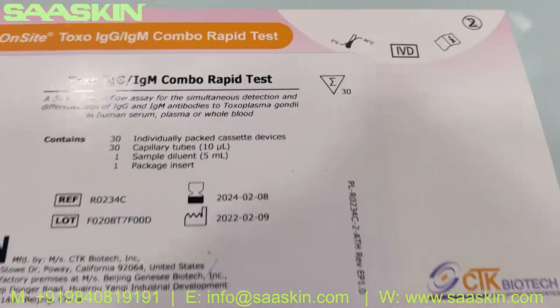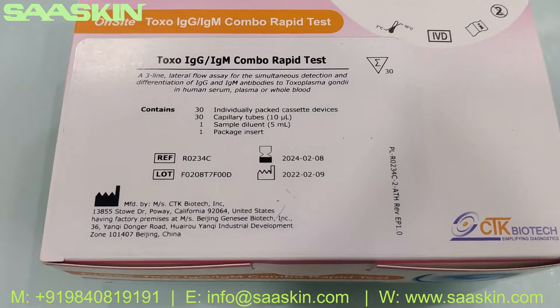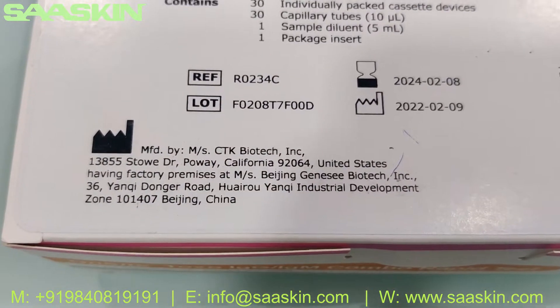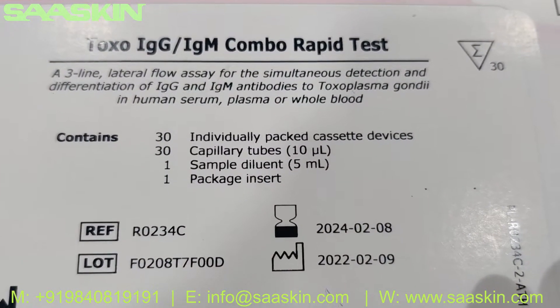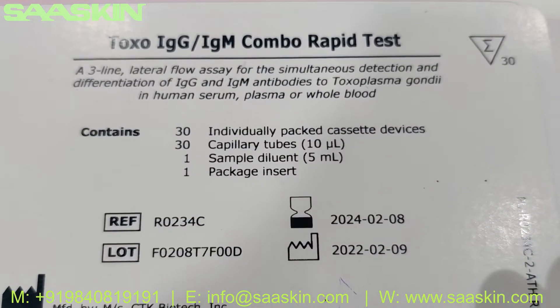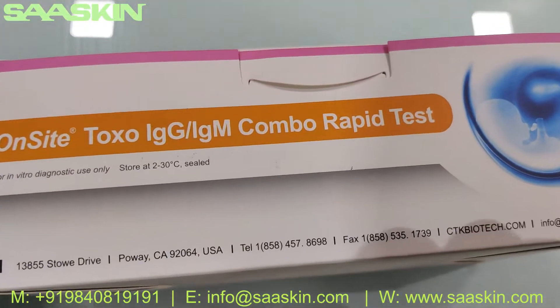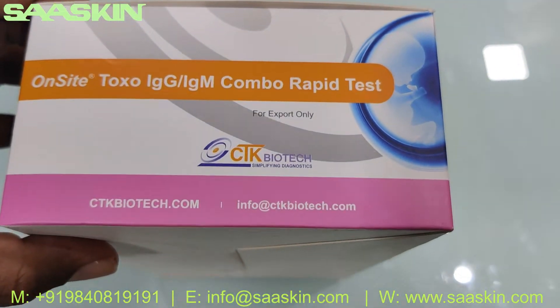This is what the box looks like — this is basically the 30-test kit box, a complete IVD certified product. It has a standard validity of two years. It contains inside 30 individual packed cassettes, 30 capillary tubes of 10 microliters, one sample diluent buffer, and one package insert.